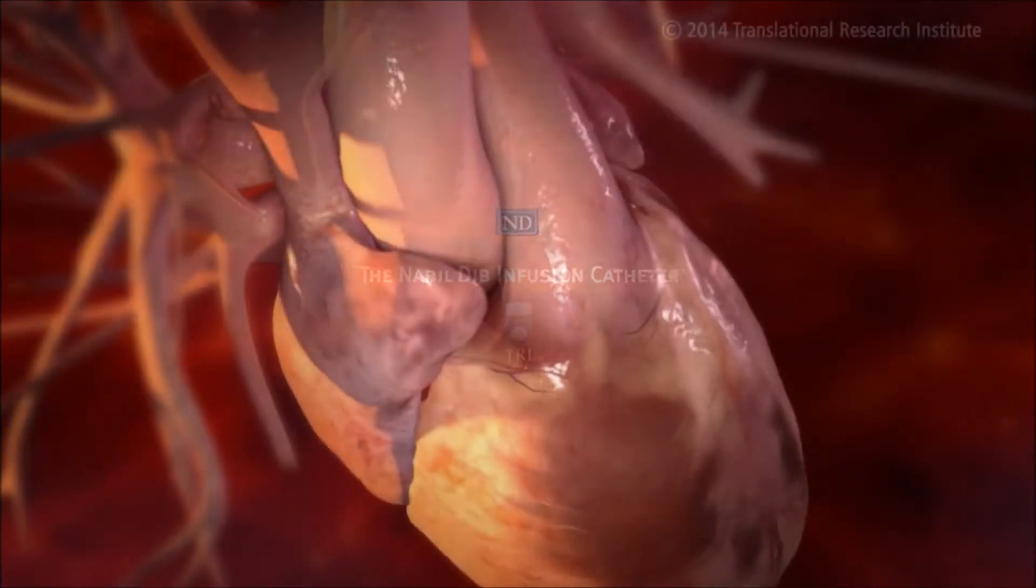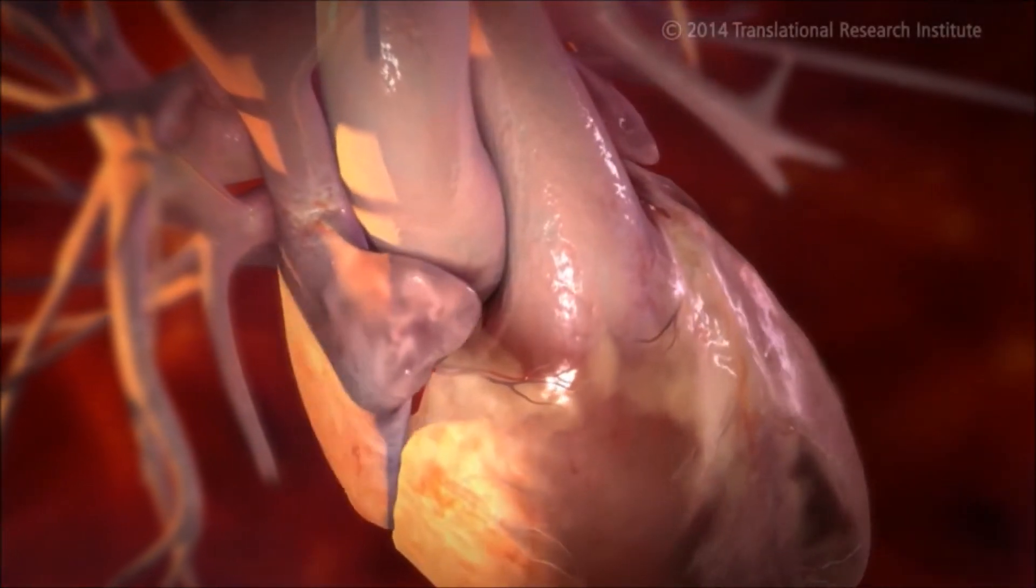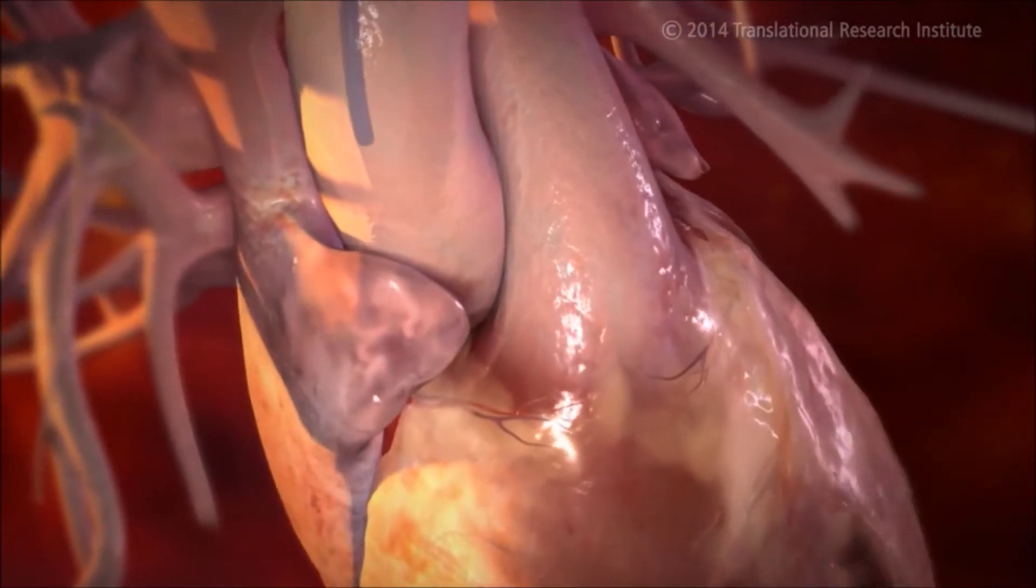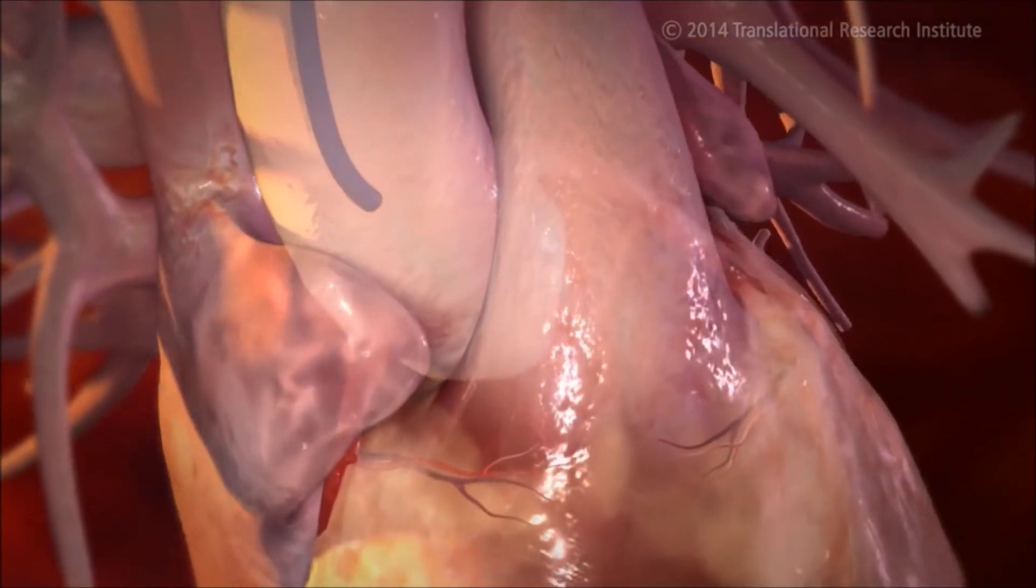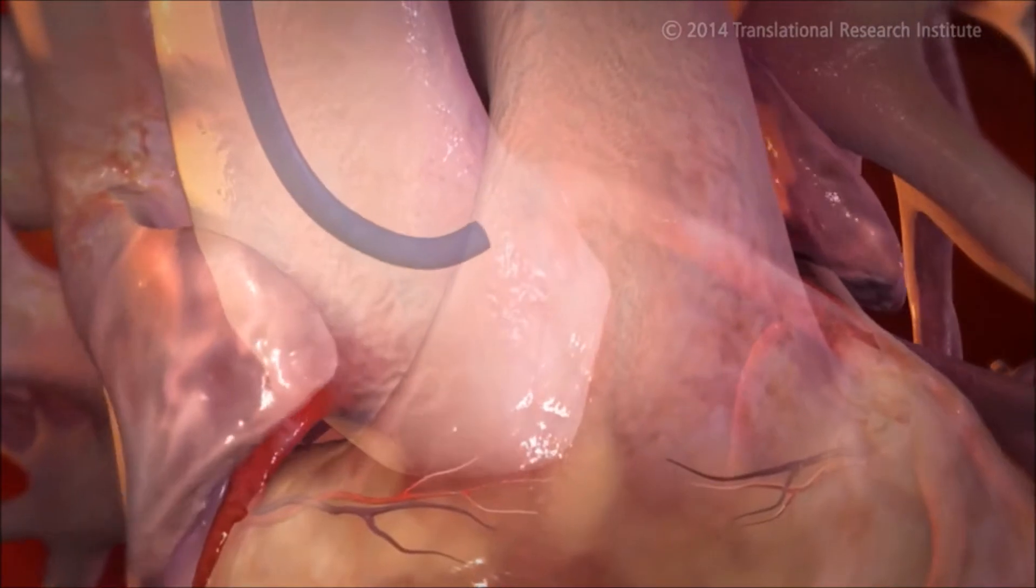A guide catheter is introduced into the femoral artery, navigating through the aorta and across the aortic arch, accessing the main coronary ostium.